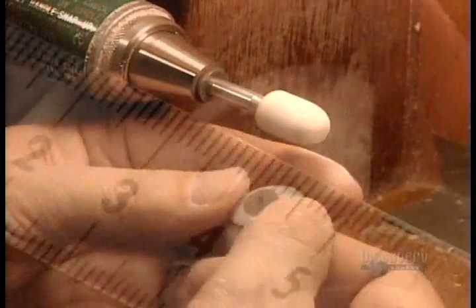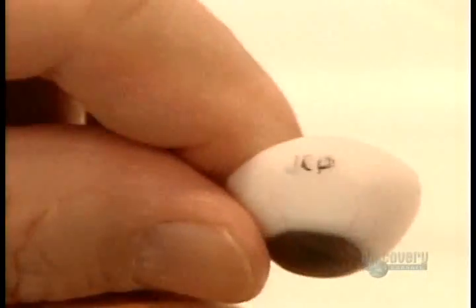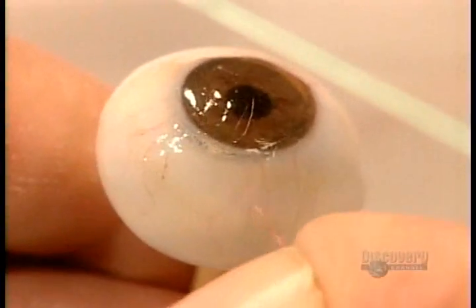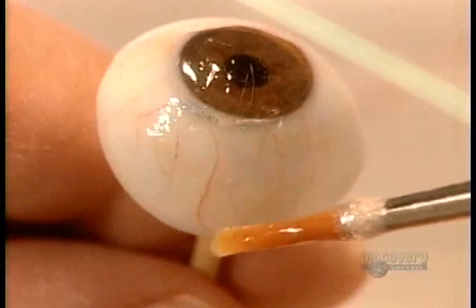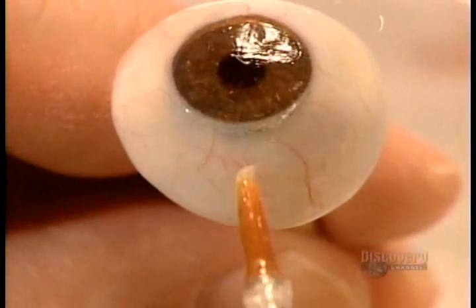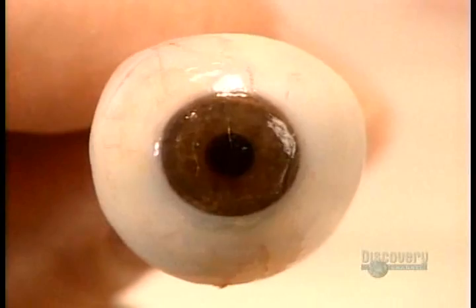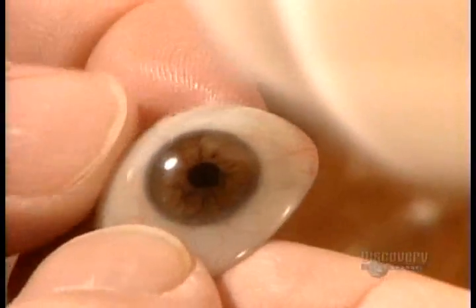They smooth the surface against a grinding stone and verify the measurements. Then, using hard colouring pencils, they add finishing touches to the iris and draw blood vessels. They label the eye with the patient's initials, then apply an acrylic coating to seal the pencil marks. To create veins with some dimension, they use the same acrylic coating to stick on some delicate silk threads. Once they're satisfied the artificial eye is a perfect match, they seal the artwork with another acrylic coating. Once that cures, they polish the eye to a shine with a cotton wheel.